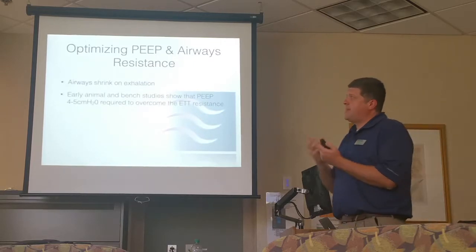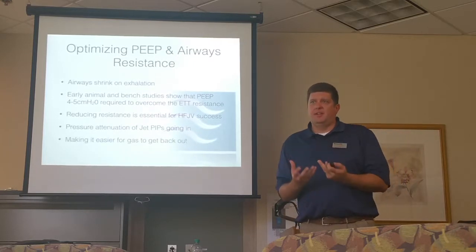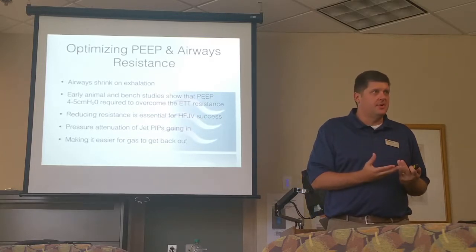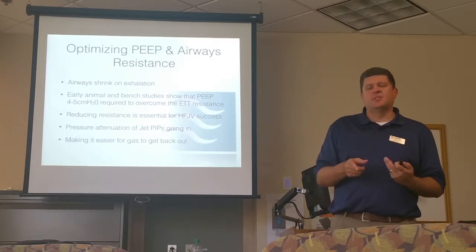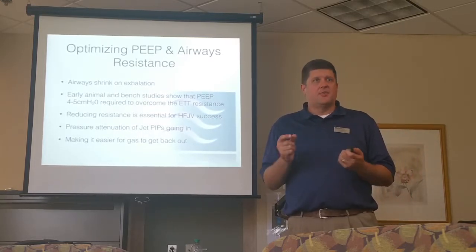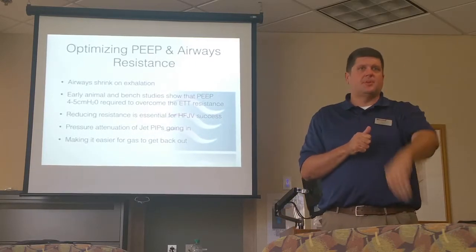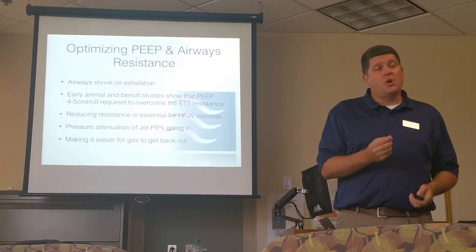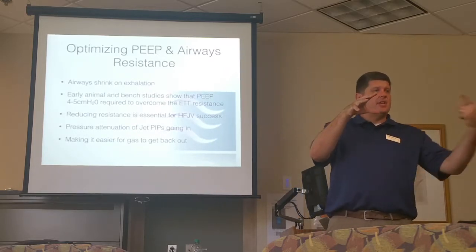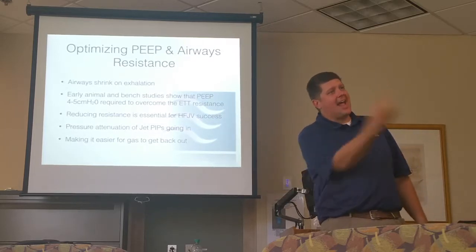So the reason PEEP is so incredibly important is that it's not just an oxygenation thing. PEEP actually enhances ventilation because of airways resistance. With high frequency ventilation, both jets and oscillators, the greatest impedance to effective delta P delivery is the airways resistance. Okay? So if the airways are smaller and resistance is high, your applied delta pressure just drops off like crazy and it's ineffective. So if we have PEEP dialed in right, not only are we making it easier for the jet gas to get downstream, but more importantly, the gas that's trapped can get out.